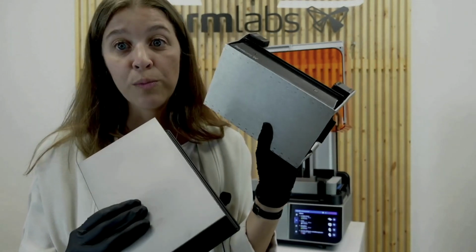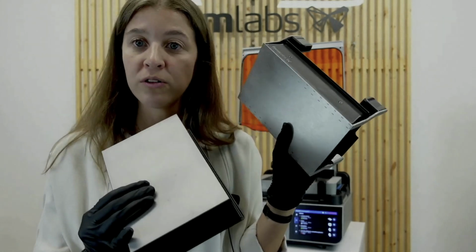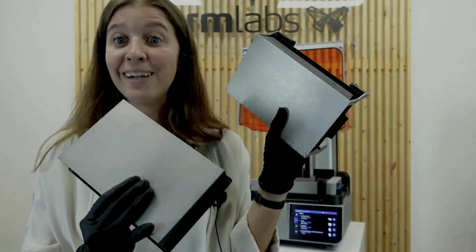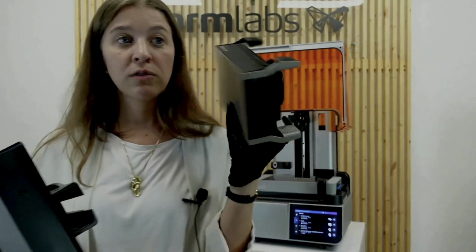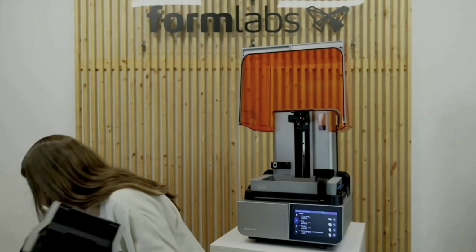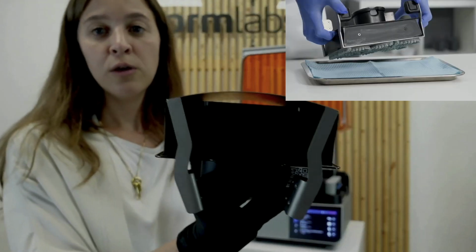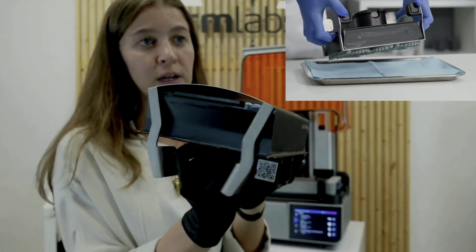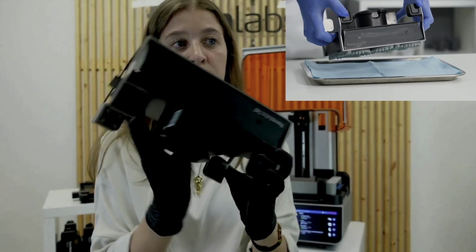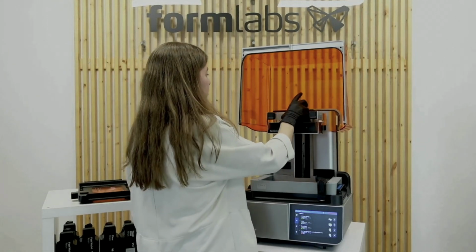When you open PreForm, you also see that you have a grid where you're orienting your parts when you're giving orientation, adding supports, or maybe snapping the model's base directly to the build platform. That surface is exactly this one. So for the purpose of this demo, I'm going to be using the build platform flex. The build platform flex, as I mentioned before, has a quick release technology, which enables me to snap out the parts after the print is done. It's really convenient because it streamlines that part of the workflow of removing parts from this surface.